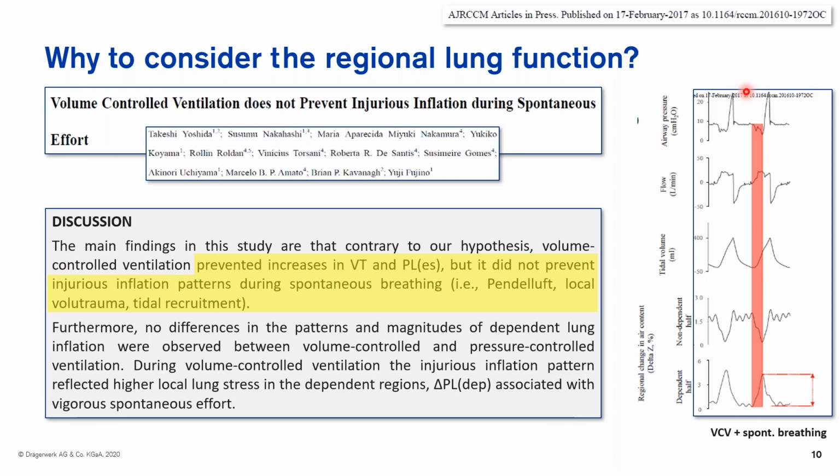But it did not prevent injurious inflation patterns during spontaneous breathing. They were referring to such conditions as pendelluft, local volume trauma, or tidal de-recruitment and re-recruitment.